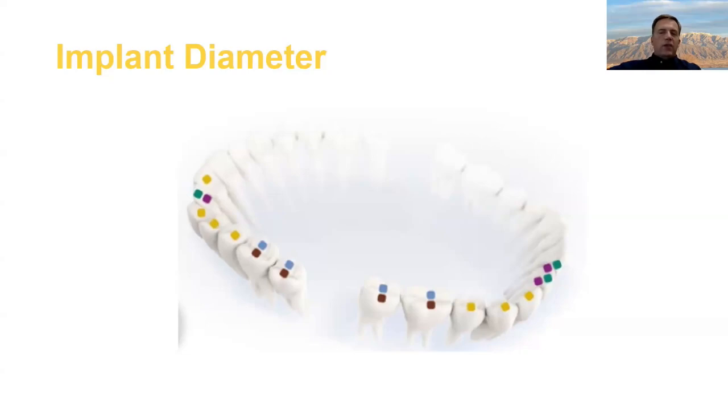And you'll notice that I'm emphasizing implant diameter and not length. Strain gauge studies that have been done show that the majority of the load on an implant is at the platform. And once you get beyond 10 millimeters of length, the rest of that implant's along for the ride once it's integrated. It's holding the implant in place, but it's not resisting a significant amount of occlusal force. So when we're trying to deal with heavy load, let's say we have a large, strong patient and we're putting molar implants in, if our option is to go wider or longer, we always want to go wider because that's going to resist that load better.